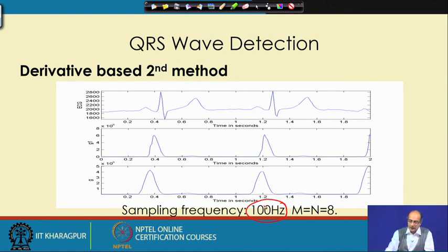Okay. So, after that, once we get the ECG signal, G1 is calculated and G1 is already pretty smooth, which becomes smoother after taking the MA filter, and the order of the MA filter in this case is 8, as well as the number of points preceding and following the peak that should be lower than the peak, that is also taken as m. The choice of m is 8.